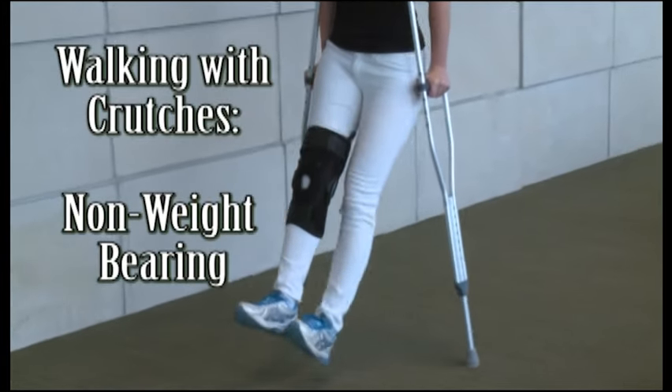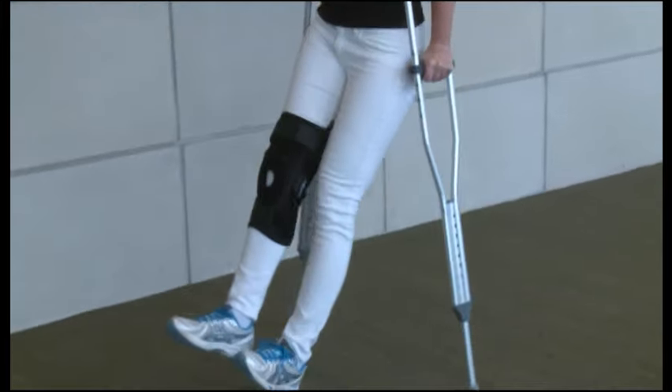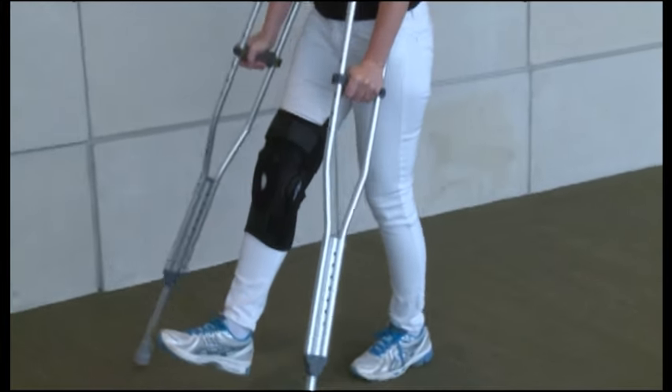Walking with crutches non-weight bearing. It is very important to follow your doctor's orders regarding your non-weight bearing status.